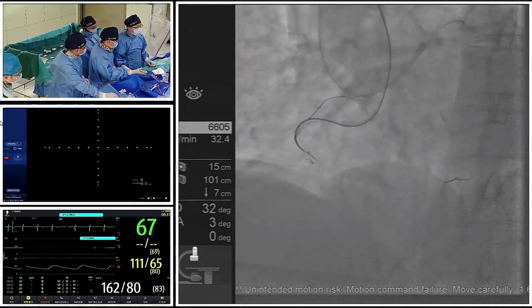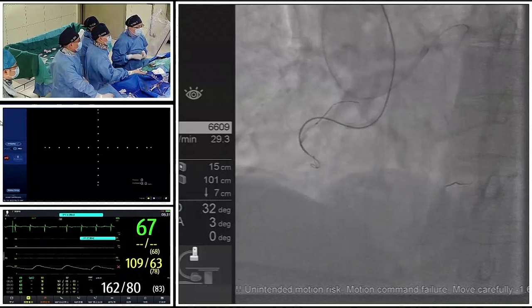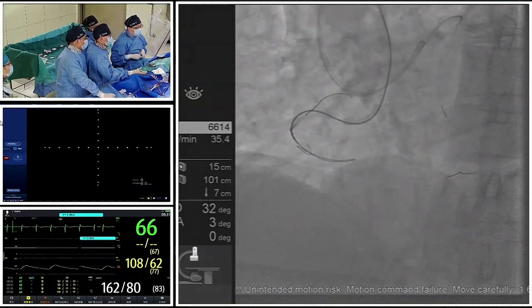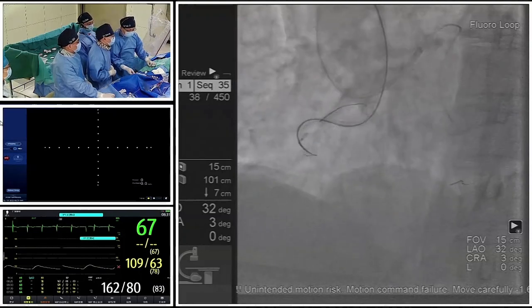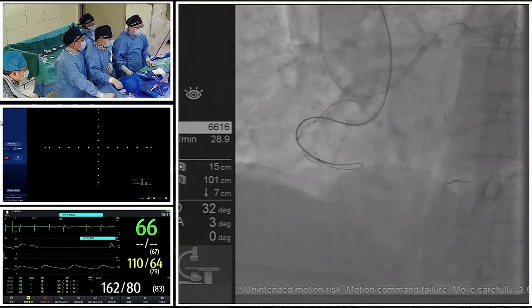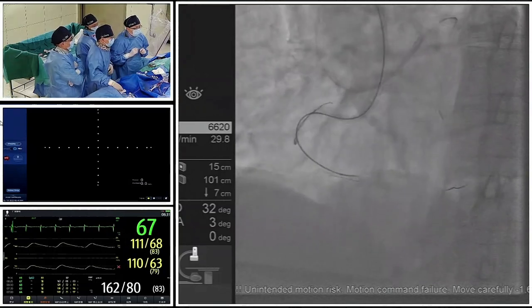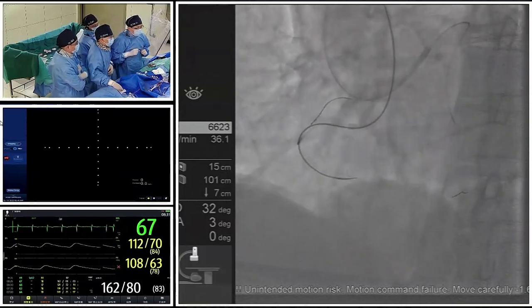Here should be a very tortuous segment. Sometimes, in order to make the wire go through the vessel structure, the knuckle technique would also be tried. Because I use the ULTRA wire, as we know, the knuckle tip is relatively small and makes a small curve. And the hydrophilic coating is friendly to the knuckle movement, so it avoids making a big hematoma.